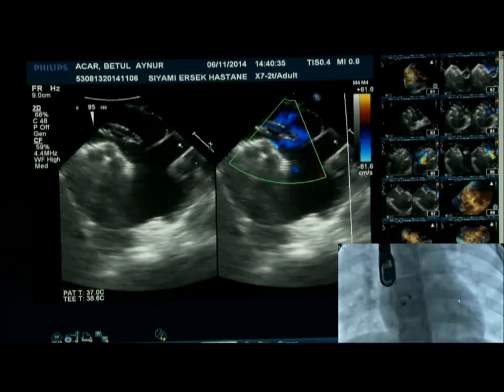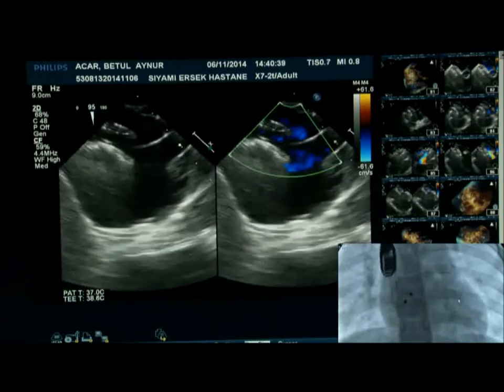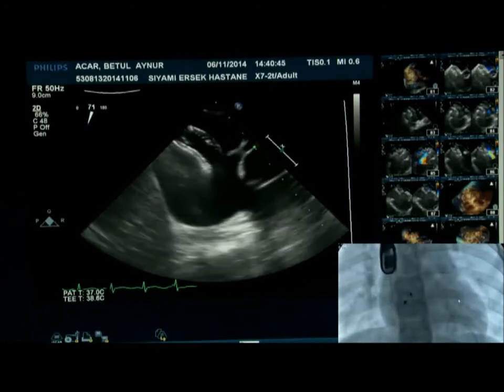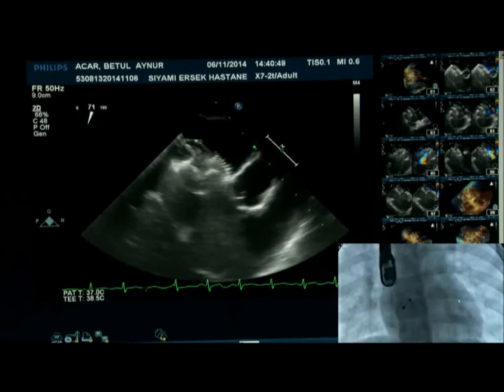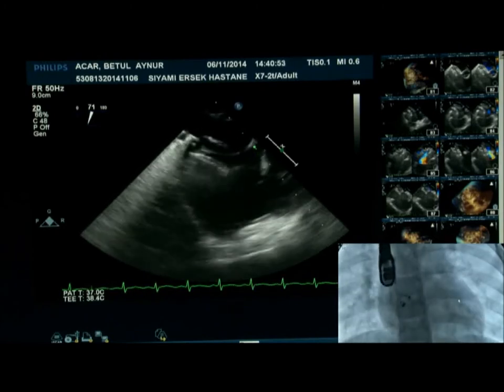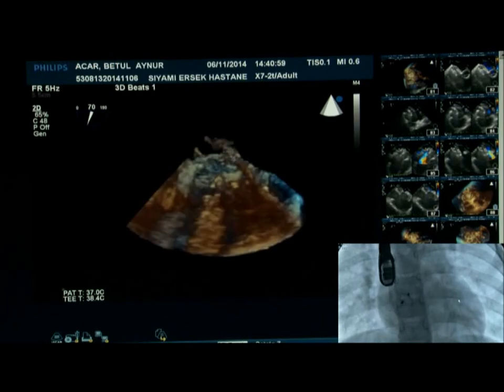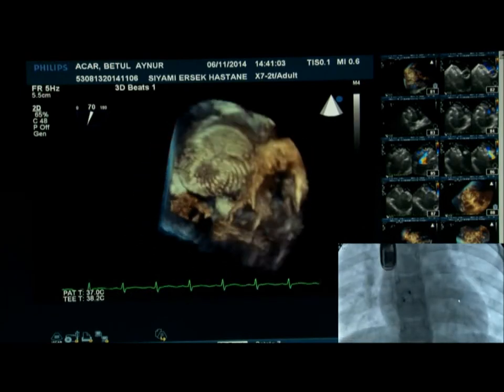I have just a comment. When you have this kind of multifenestrated defect, like what you did, Shak, where you went in 2-3 times, it is maybe good to have a balloon and keep the balloon inflated, use the other groin and try to cross the hole with the other catheter. That makes it easy. The worst thing is that you have to put in another access. Yeah, I think the balloon in this particular type of morphology has an important role, partly to size it, but more importantly to cross the main or the correct defect.